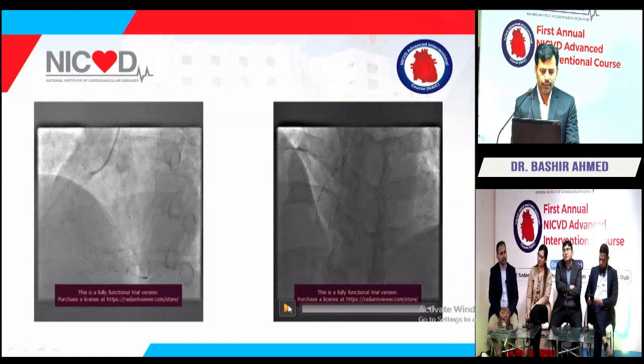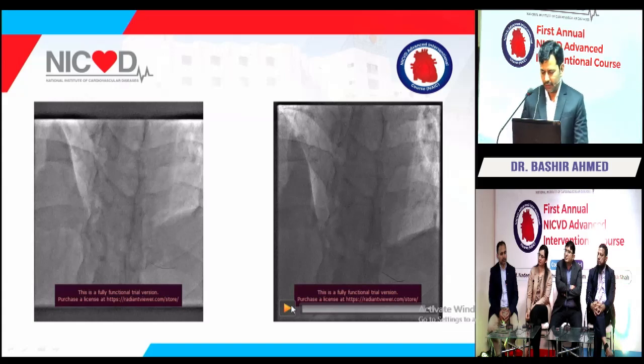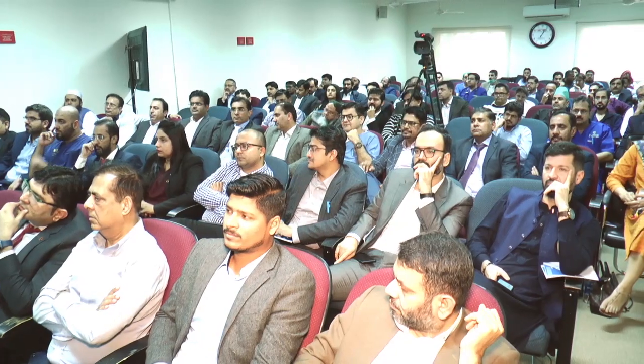So we did this case in 80 to 100 ml of dye, and we had planned that if we needed dual injection, then we would consider it. The wire was parked in the PD and then pre-dilated with 1.5 and 2 balloons, and then 2 stents were placed in RCA. After a week of stay, a staged PCI to LAD was done in this case.